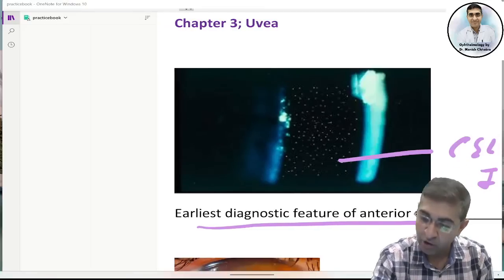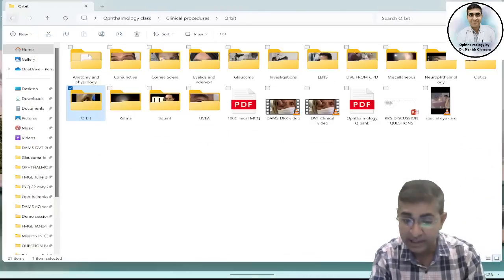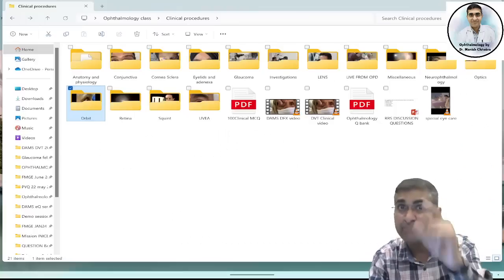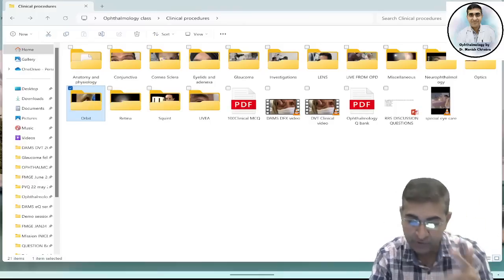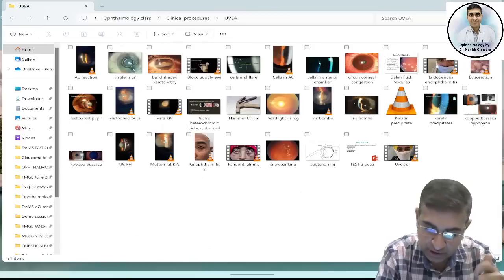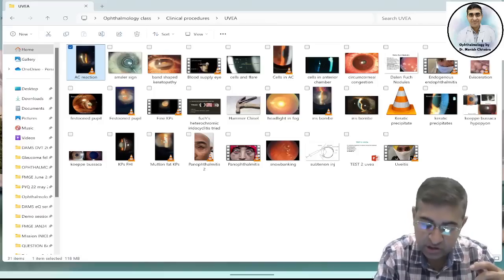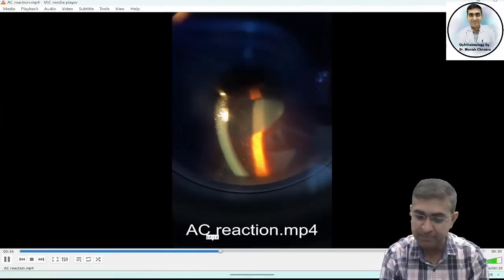Of course, I'll not be able to show you all the associated videos that I show in the class, but some videos which I feel will help you remember the important points throughout your exam and even after that, I'm definitely going to show you. One of those videos is the cells in the anterior chamber. So check out the cells in the anterior chamber. You are actually going to appreciate the cells which are present in the anterior chamber.